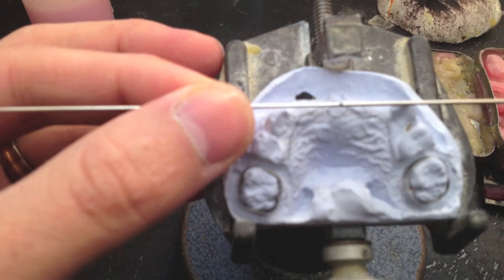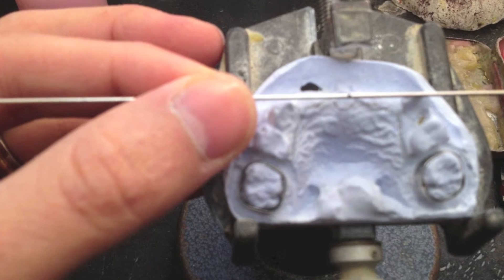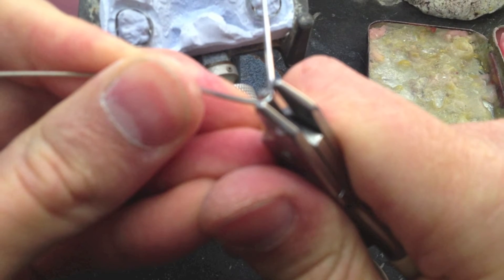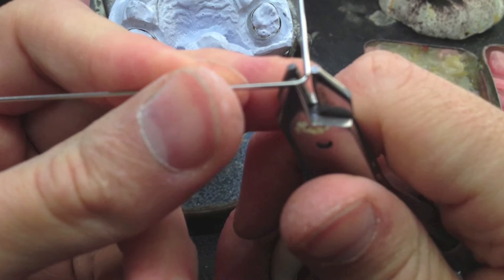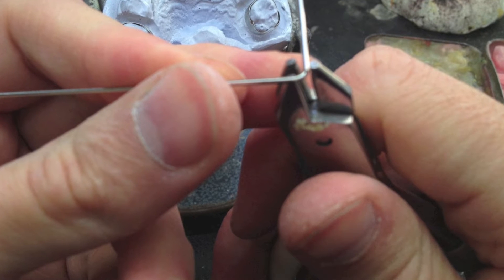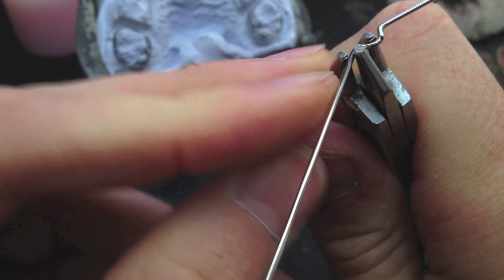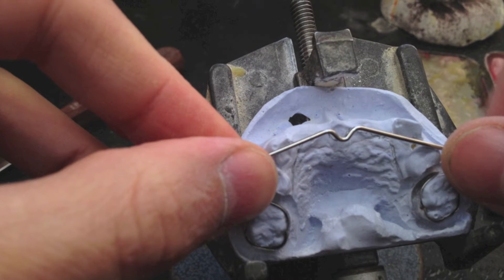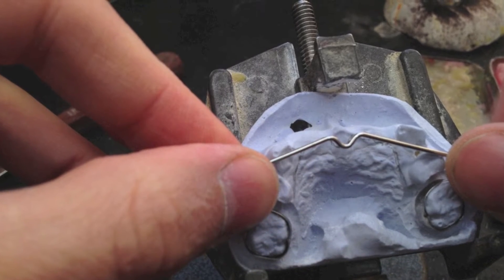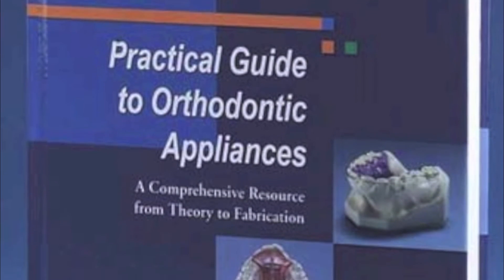Here I am bending the main support wire for this appliance, the lingual arch. Sorry, the pictures are out of focus again — my camera is on a 5-second interval. There are many methods for making a pedo partial. This one just involves a simple little bend like this. I picked up this method from the Great Lakes book, the one seen here, 'Practical Guide to Orthodontic Appliances.'